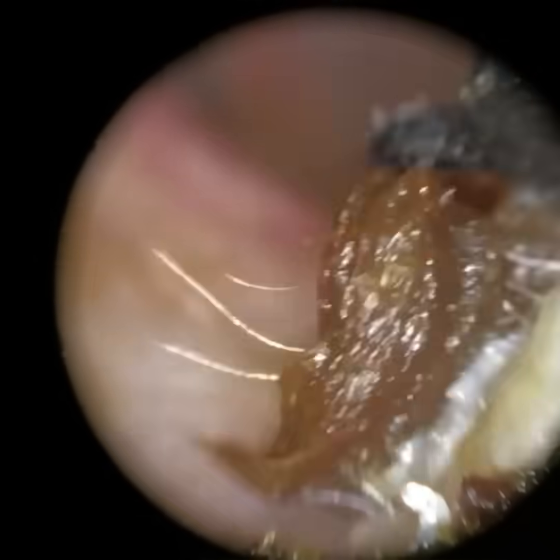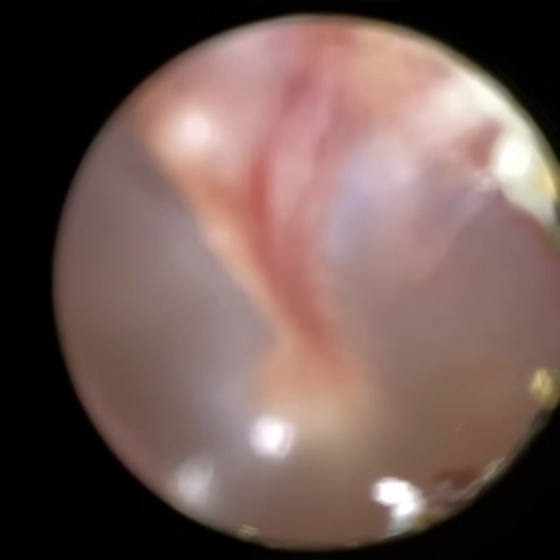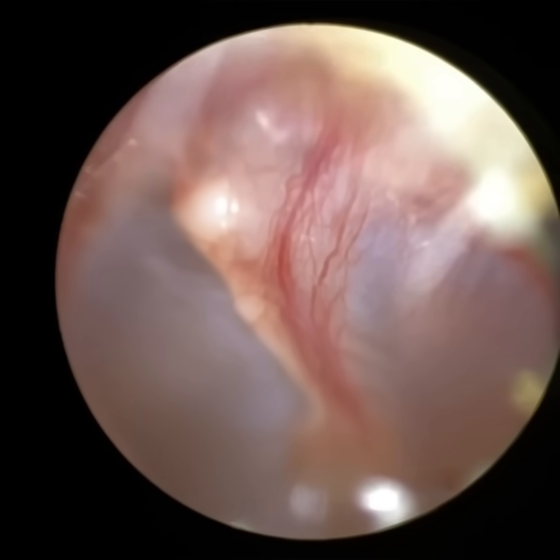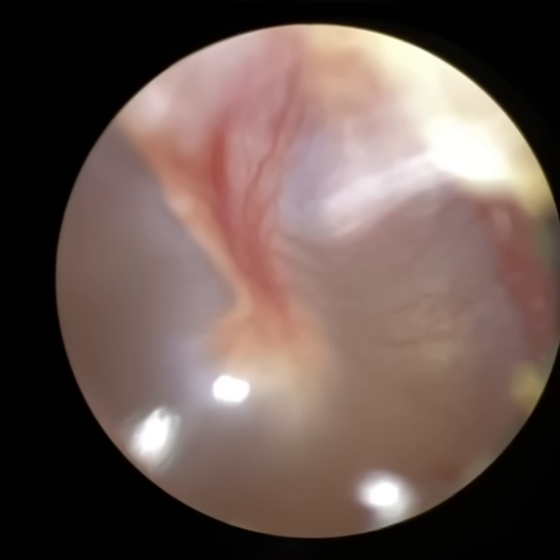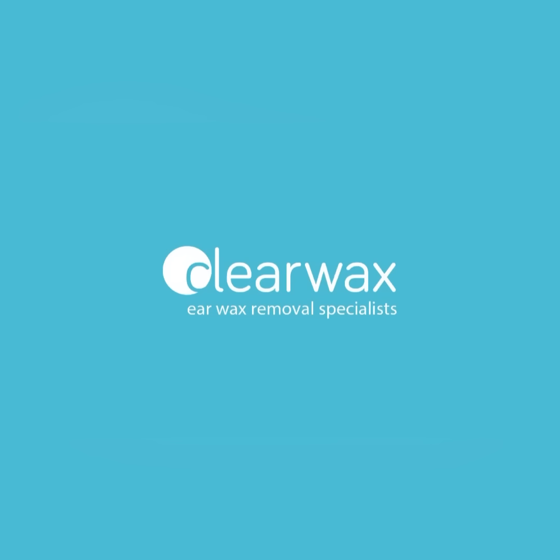You can see we managed to remove all of that using a combination of the Rykerette, the ear hook, and the ear pick. We've got a lovely view of this patient's eardrum. I'm just adjusting the focus, and you can see all those blood capillaries supplying blood and nutrients to the hammer bone. I hope you enjoyed that video. If you are interested in the WaxScope, please email info@clearwax.co.uk. Thank you. Bye.